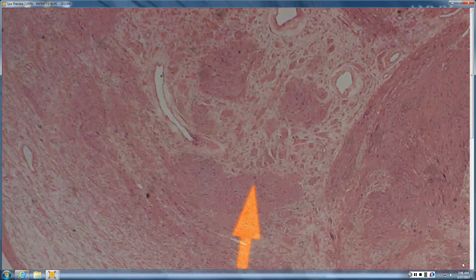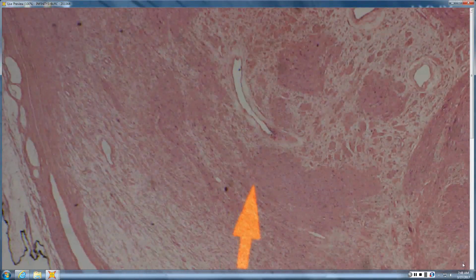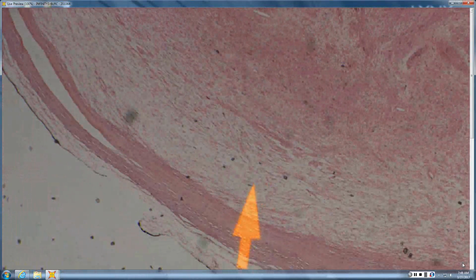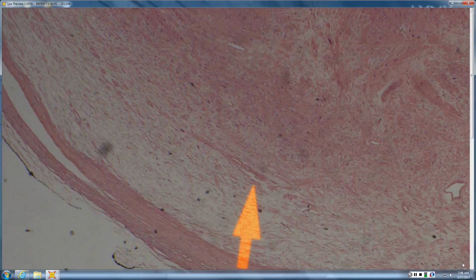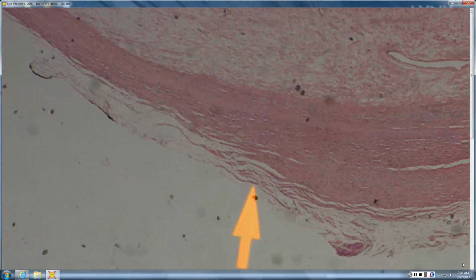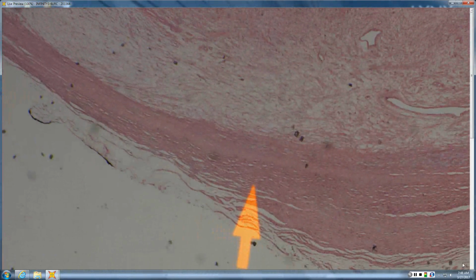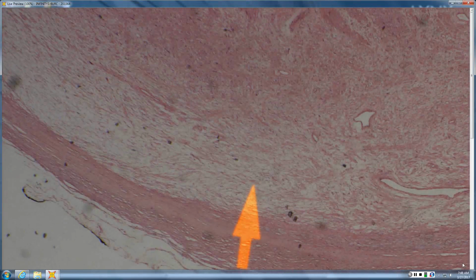Okay, how about this one? This one is arranged kind of in fascicles. It's definitely got some large pleomorphic nuclei. You can see it at scanning magnification, and at the very scan, is it encapsulated or non-encapsulated? It's more like a schwannoma look to it. Yeah, so it's a big round ball that's encapsulated and has a crescentic zone of subcapsular edema.